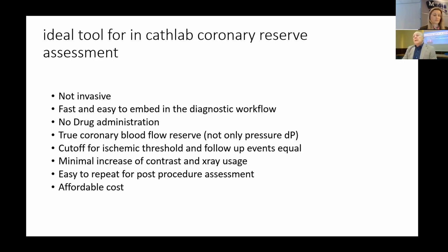What is the ideal tool for coronary reserve assessment in the cath lab? These are some points that I want to underline here. The tool must be non-invasive, fast to use, and easy to embed in the diagnostic workflow. No drug administration. It should give not only the pressure, but also coronary blood flow reserve indication, and the ischemic cutoff threshold must be the same or nearly the same in follow-up.